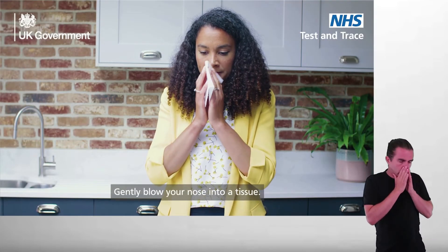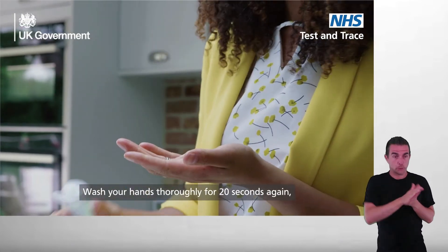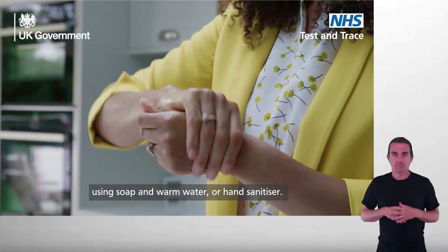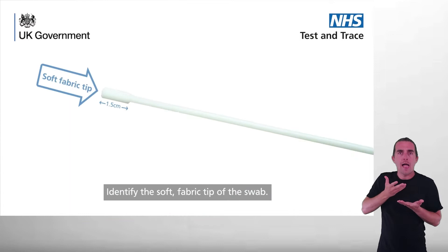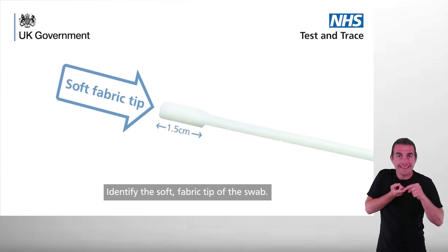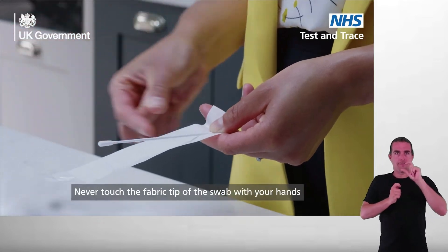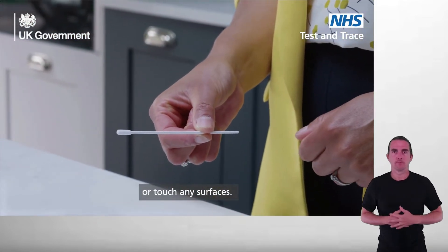Gently blow your nose into a tissue. Wash your hands thoroughly for 20 seconds again using soap and warm water or hand sanitizer. Find the sterile swab in the sealed wrapper. Identify the soft fabric tip of the swab. Peel open the swab package and gently take out the swab. Never touch the fabric tip of the swab with your hands or touch any surfaces.